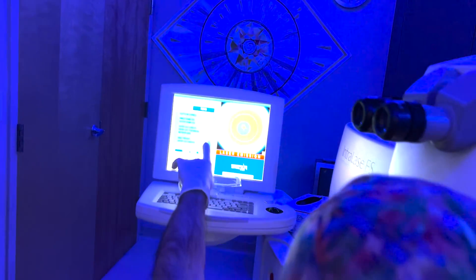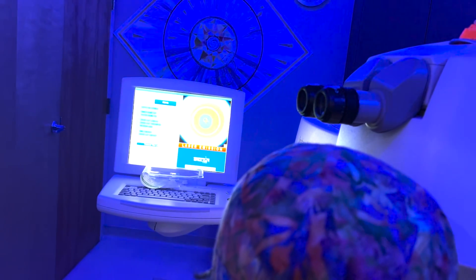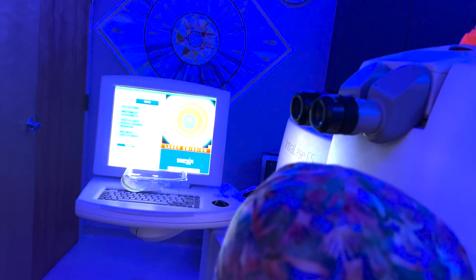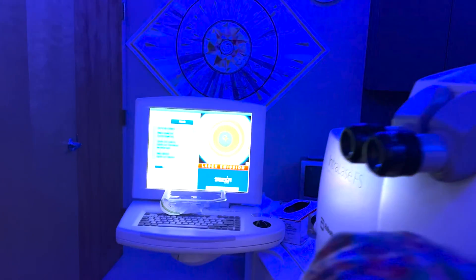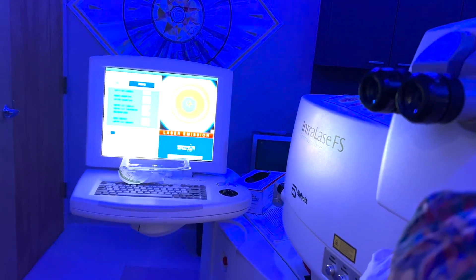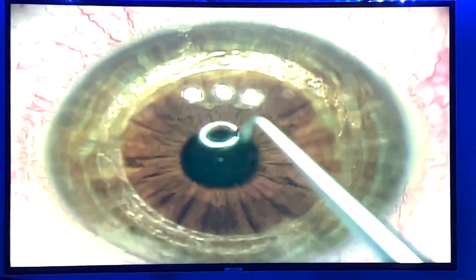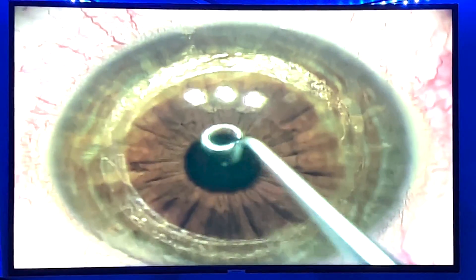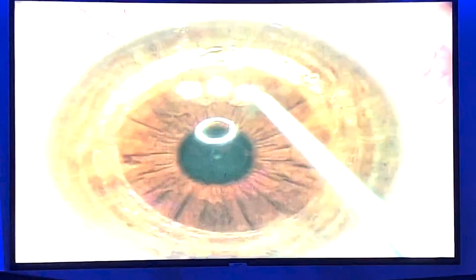You can see the incision being made 360 degrees. In this scenario, we want to plan that our ring goes in a very advanced keratoconus. You can see the axis coming up right now. So you can see now the reflexes are very oval and irregular — very advanced keratoconus.